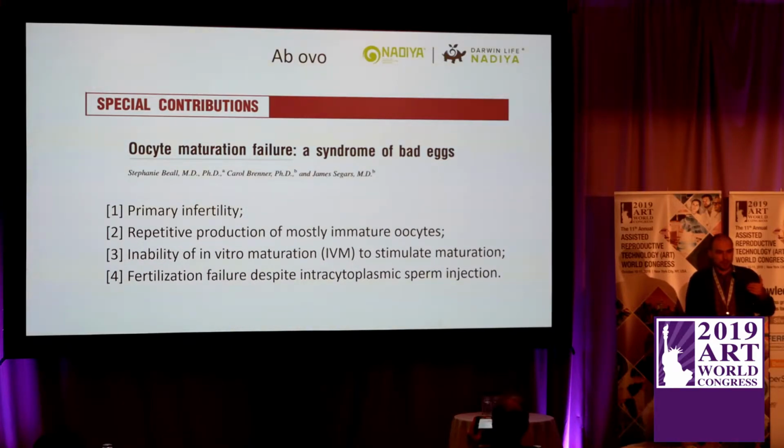She has M2 oocytes, but without an M2 spindle. They form not the spindle, but a nucleus already. So we have only a polar body and a nucleus. It's like parthenogenetic activation of her oocytes, and it happens to her recurrently. Each time she has a stimulation, we have only this kind of oocytes.